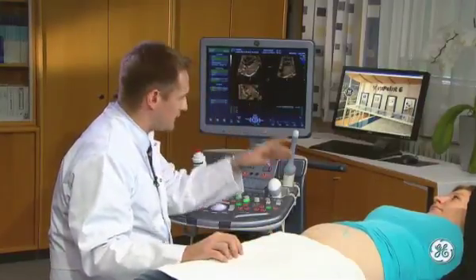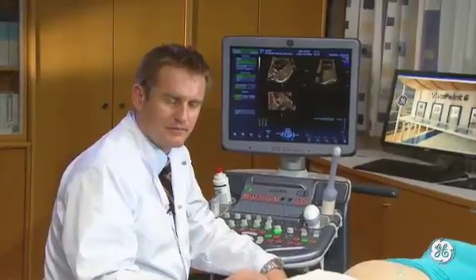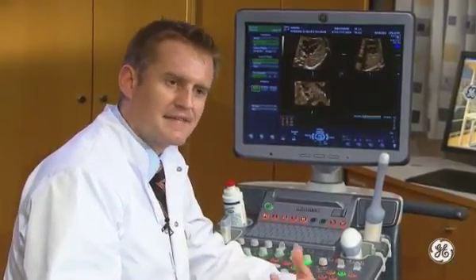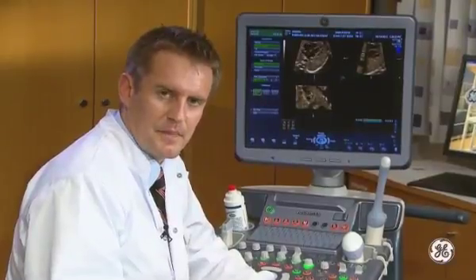After you acquire the STIC volume, you need to go precisely through the process of orientation. There are several ways described how to do that, but generally speaking, you need to use the same pattern. Then you have the reproducibility of all your STIC examinations.